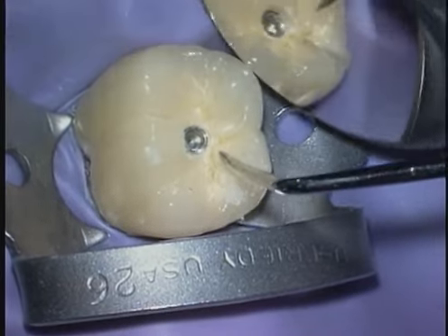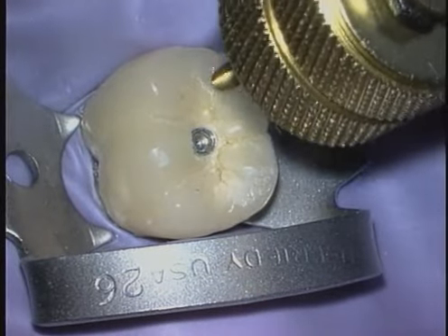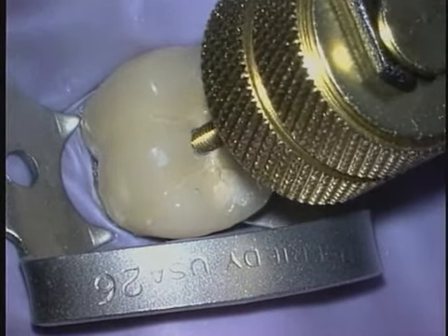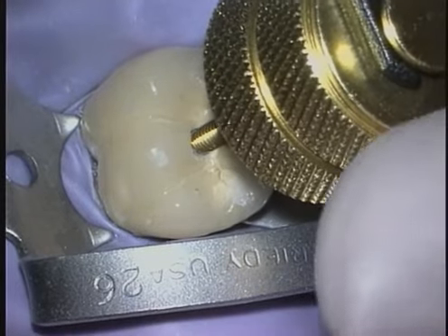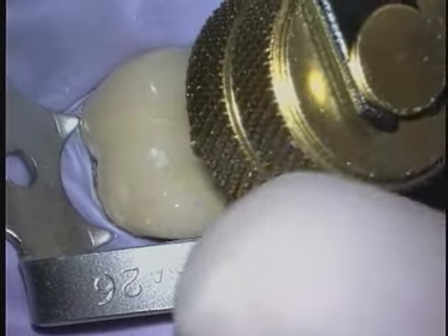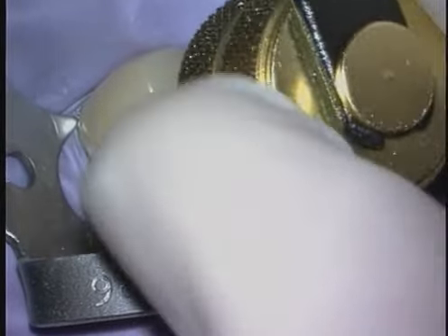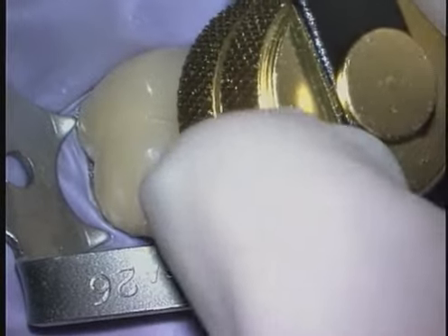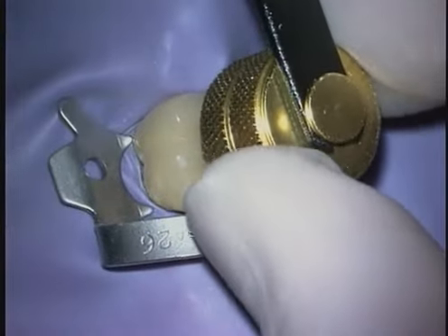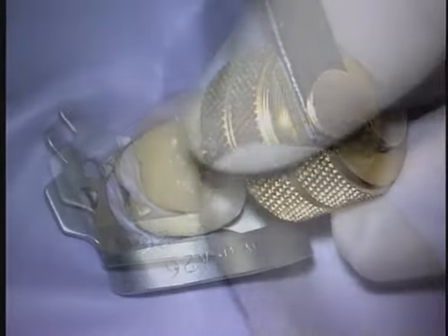With the drill removed, we can see that we have created a precise channel. In this instance, the magnum instrument is introduced into the machined opening to tap and thread the metal portion of the restoration only. The handle is turned in short clockwise rotations, which will push the distal end of the instrument against dentin. This action will generally break the cement bond and lift off the restoration.